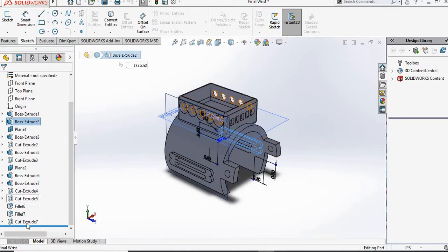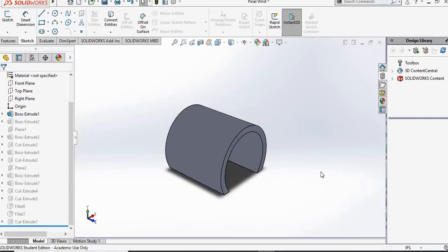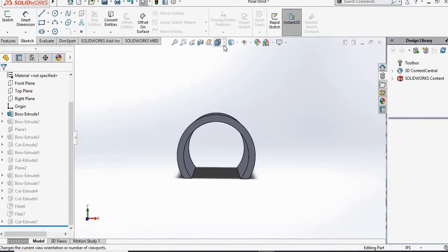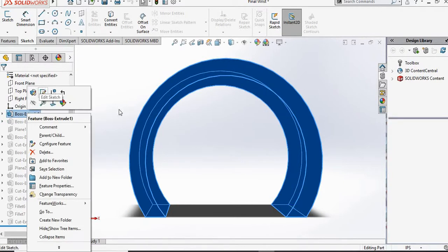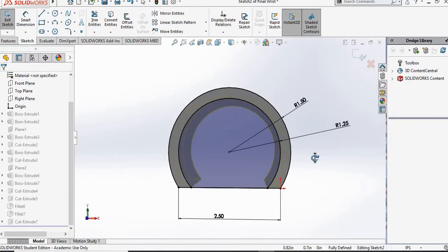Alright, so let me go ahead and get started. So you want to start off by creating this wrist bracket, okay? So you go to the front plane, okay? And you want to go ahead and create this sketch with these dimensions.